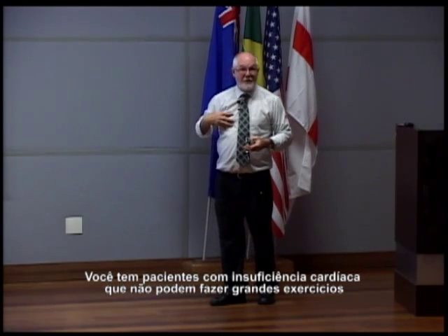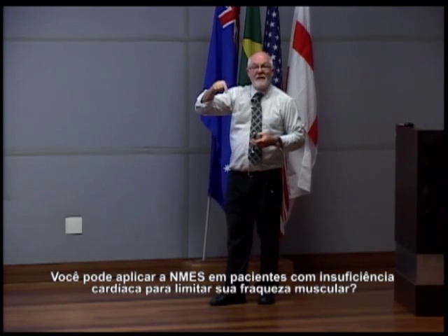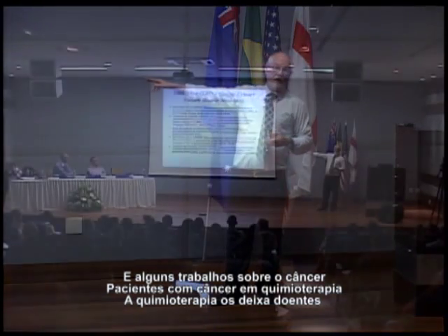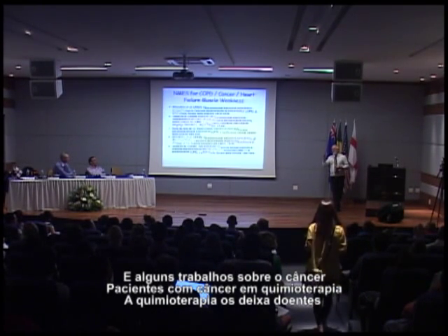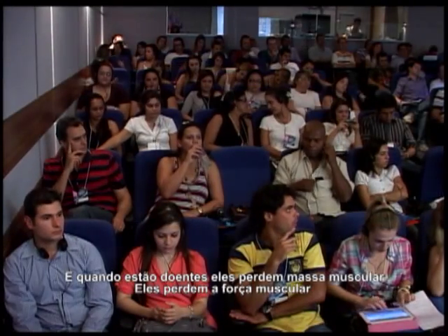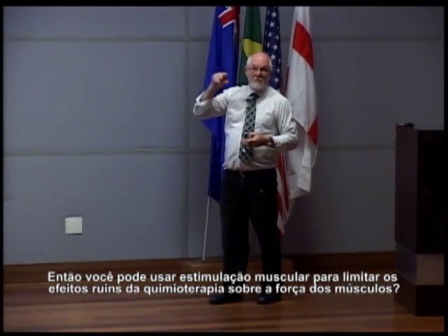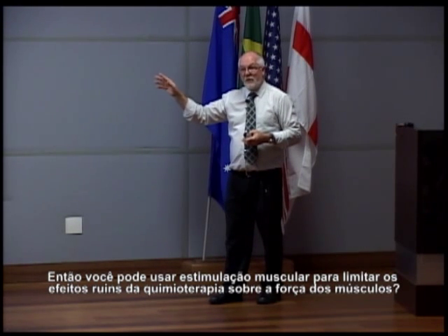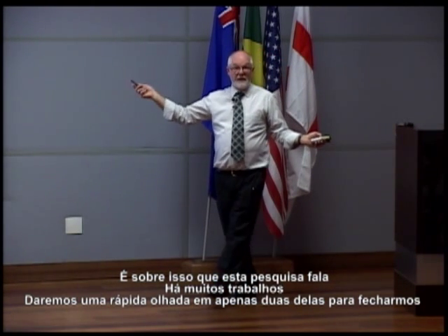You've got patients with heart failure who can't undertake big exercise. Can you do NMES to a patient with heart failure to limit their muscle weakness? And some work on cancer, patients with cancer on chemotherapy. The chemotherapy makes them ill. When they are ill, they lose muscle bulk. They lose muscle strength. So can you use muscle stim to limit the bad effects of chemotherapy on muscle strength? This is what all this research is about, and there's plenty of it.